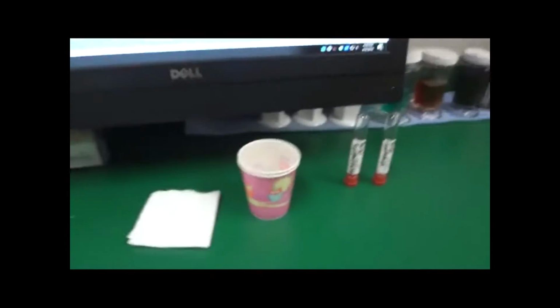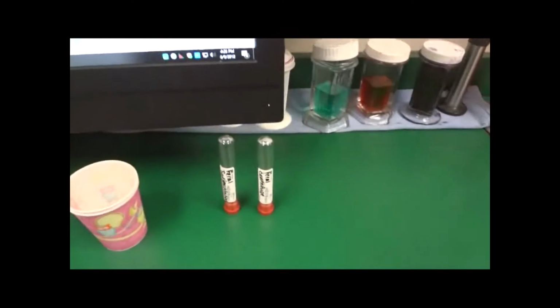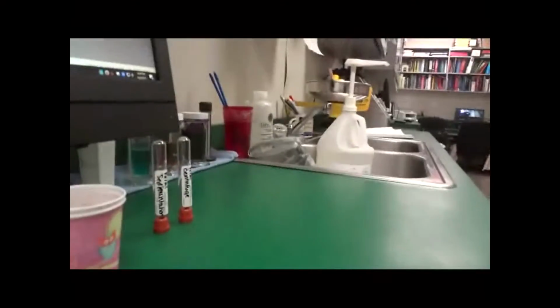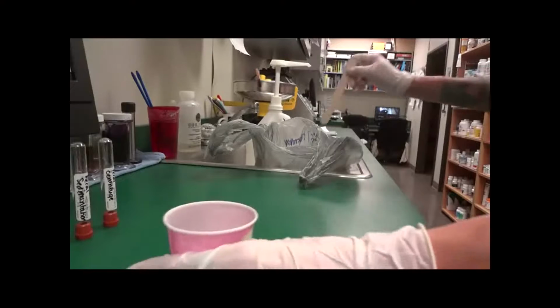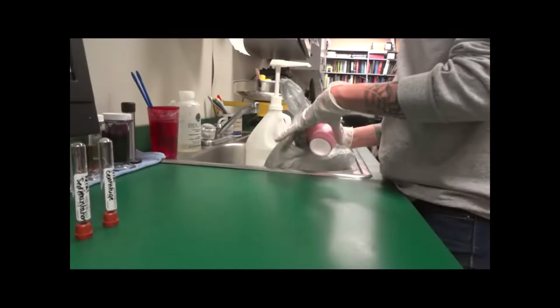Now we'll be demonstrating how we would run a fecal with centrifugation. We'll be running it much like a urine sediment or urinalysis on the centrifuge due to not having a swinging bucket centrifuge. Alright, so we've got our materials here. We've got our gauze sponge, a sample cup, the tubes that we'll use in the centrifuge, and our Fecasol. So firstly we'll mix approximately 2 grams of our feces material.